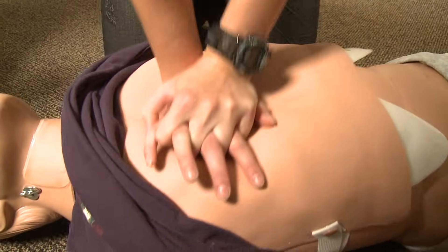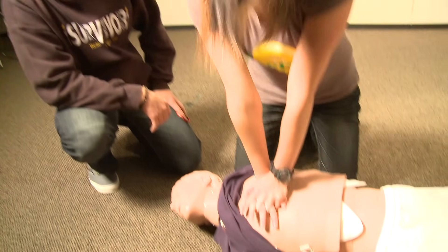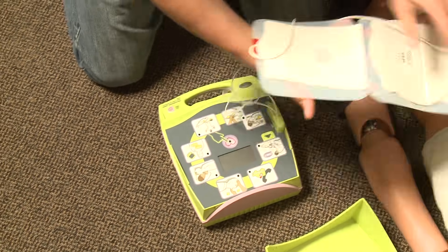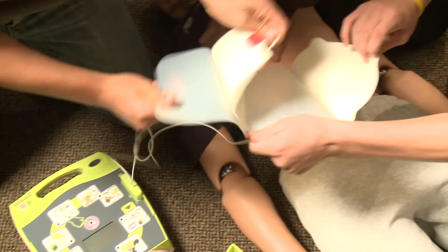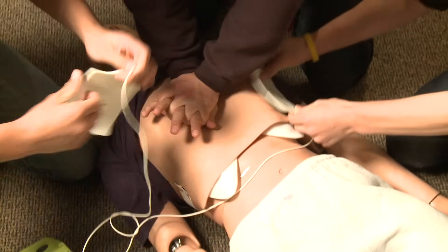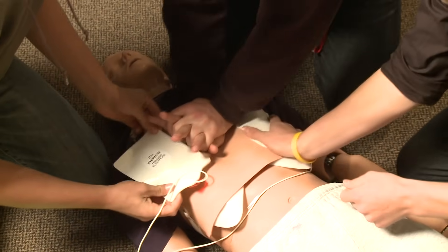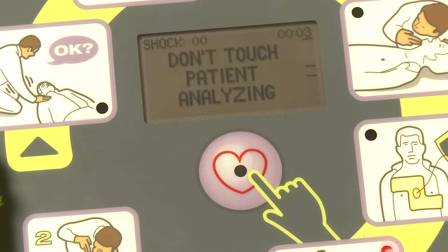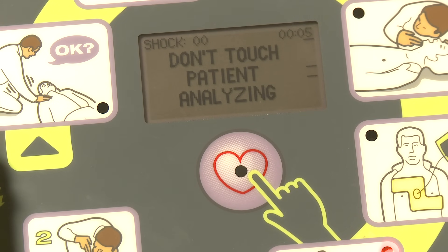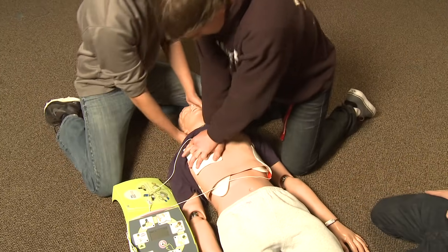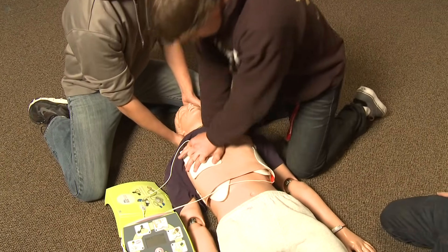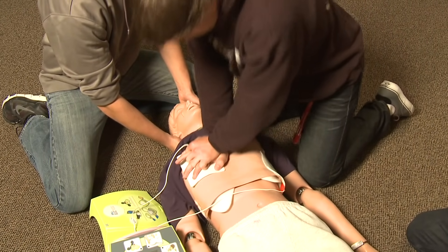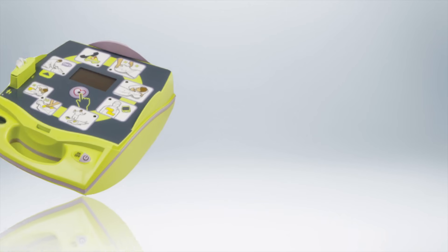You already know how to perform high-quality CPR. After today you will know how to pair that CPR training with the use of an AED. Each of you will have an opportunity to become familiar with an AED, how to apply the chest patches, and how to deliver a life-saving shock all while performing high-quality CPR. This requires teamwork to maximize the resuscitation effort, but it can be done by a single individual as well.